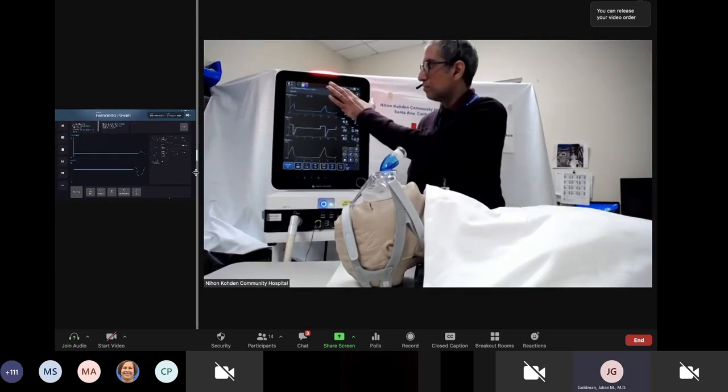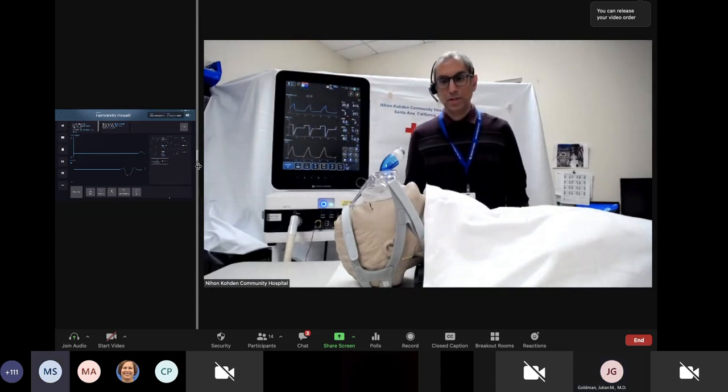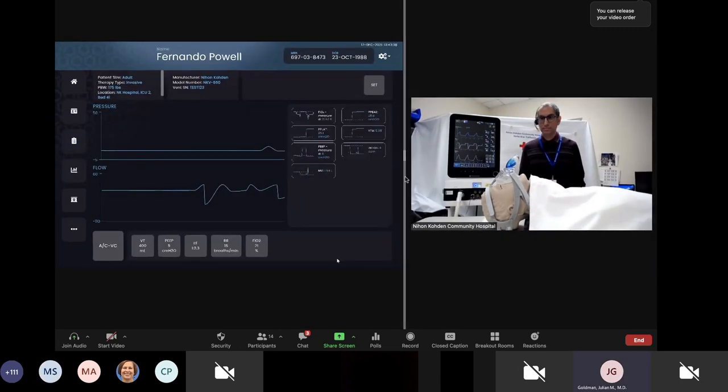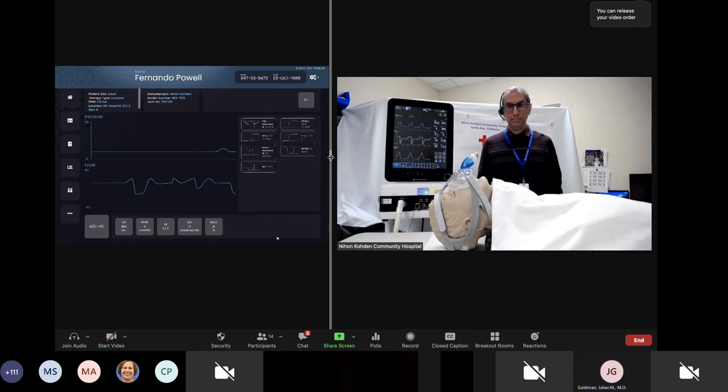Looks to us like the ventilator has been activated and is breathing for the patient, Miran. Is that true? It is correct, and the patient is doing better. Excellent. When we look at our local screen, the waveforms look a little different versus yours at the bedside. Alyssa, is this typical when you're controlling something remotely, or what's going on with those waveforms? Yeah, this is really just an interim version of the software. So the waveforms are not quite accurate or precise, but we are still developing this software. In future iterations, we will see more accurate waveforms.